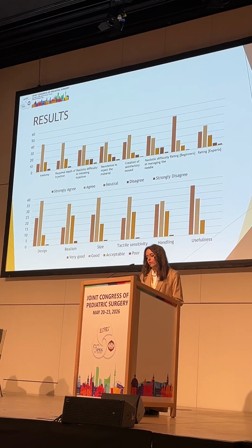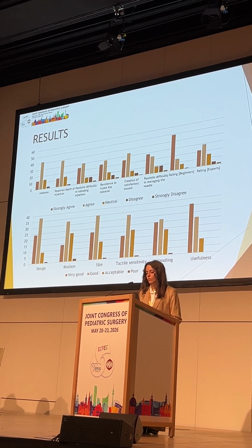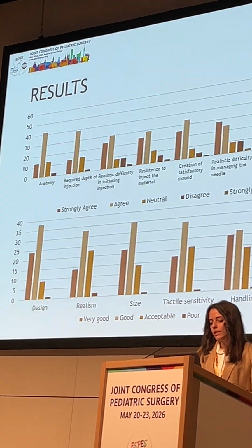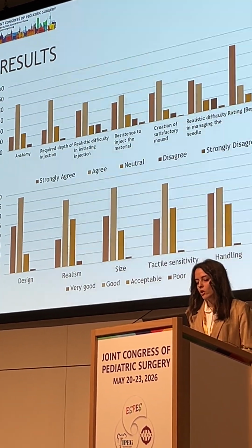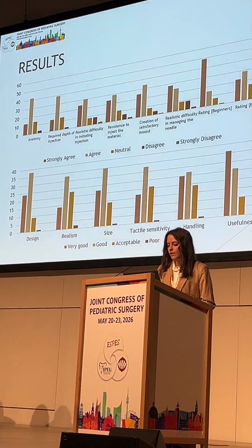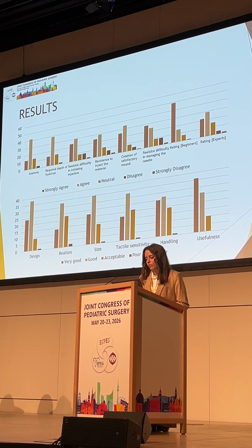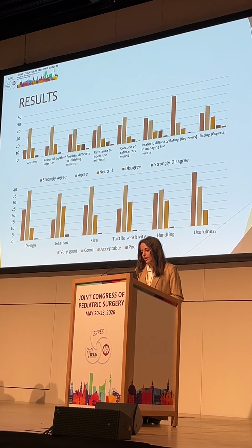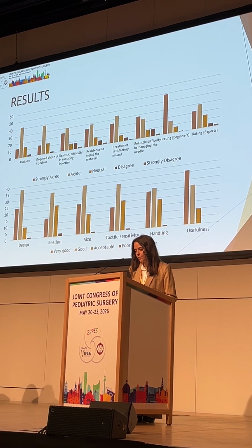Results show that regarding both face validity and content validity assessments, no statistically significant differences were found between scores given by novice versus intermediate-expert groups. Similarly, no statistically significant differences emerged between scores given by participant versus faculty group assessing the content validity of the simulator. The simulator was considered a good teaching tool for beginners by 87% and for pediatric surgeons by 69%. So overall, both groups found the tool useful and effective.